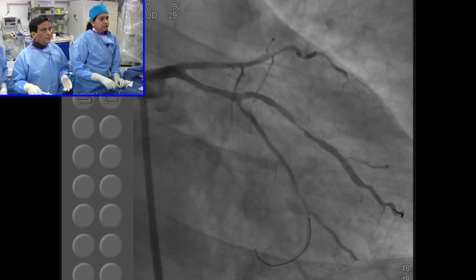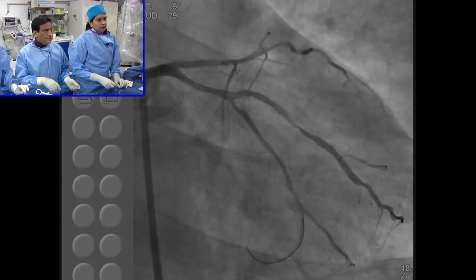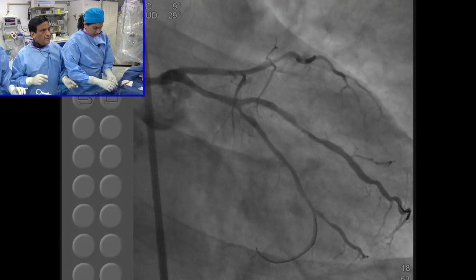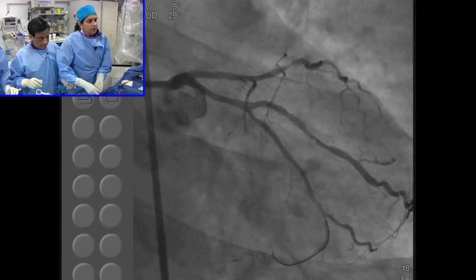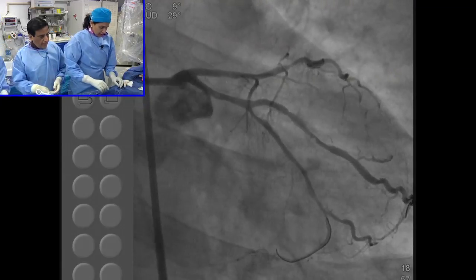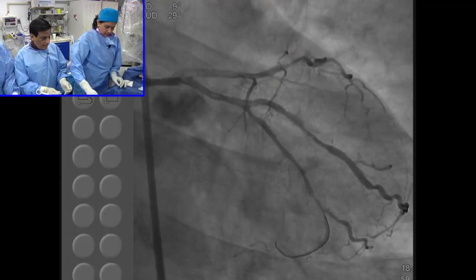That area is more of a soft and pseudo lesion. Good. Okay. Let's go to the main vessel with this. But what if the plan is to cover it, right? Yeah. But I don't know that 38 even will cover completely. We can do the same way, that we can put a 38 up to the main vessel longer. Here. No, let's dilate the main vessel now.